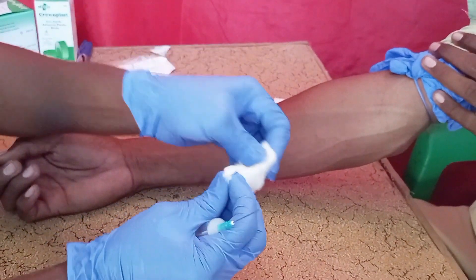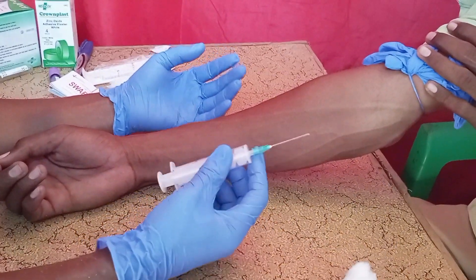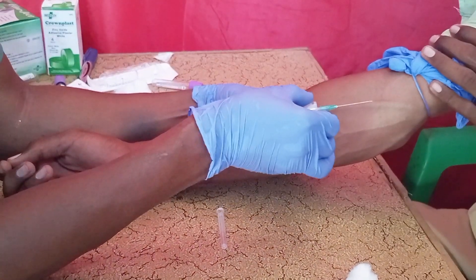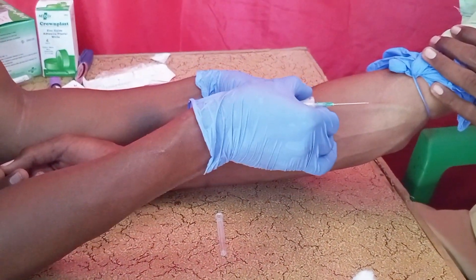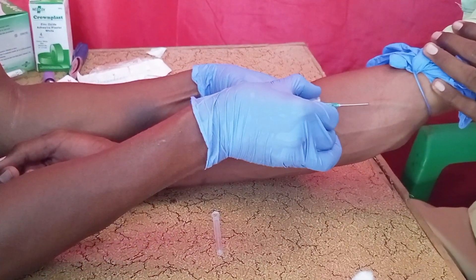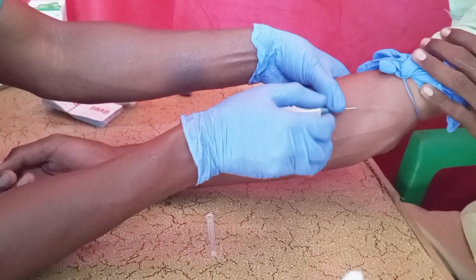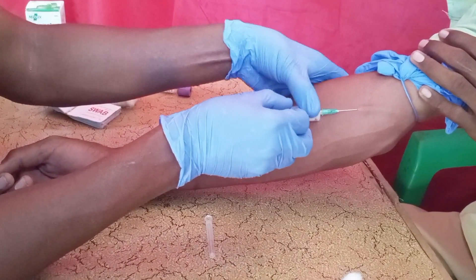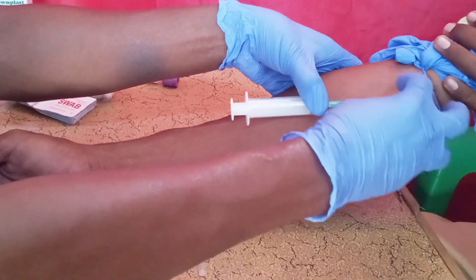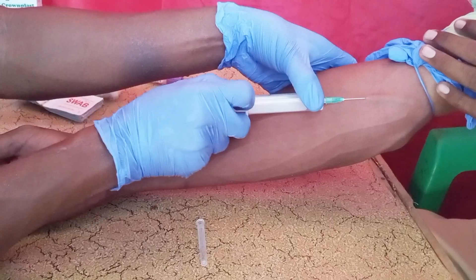Prepare your cotton wool because you will apply pressure on the area where you have given the shot. This is the vein — now I am going to start. You insert the needle first, and when you insert it you will see a flash of blood in the hub of the needle, then draw back the plunger so blood rushes into the barrel of the syringe.